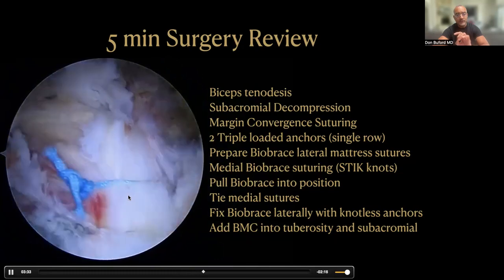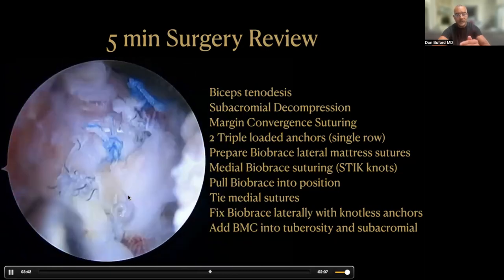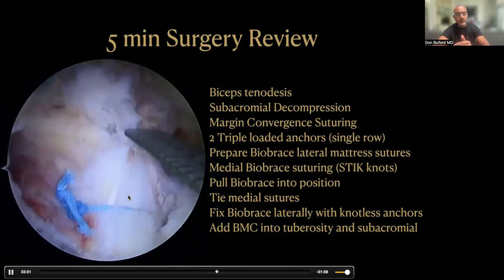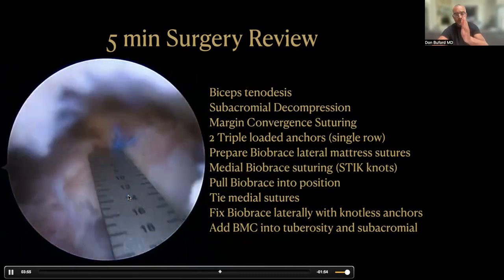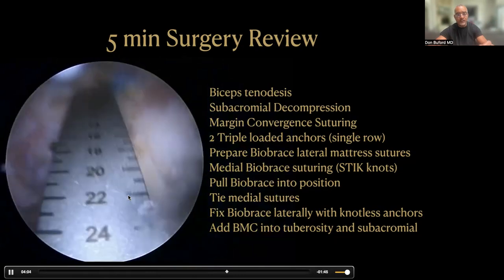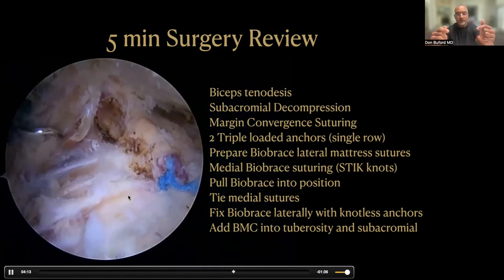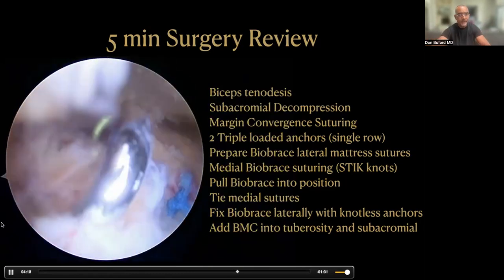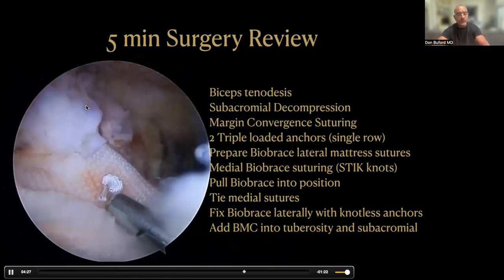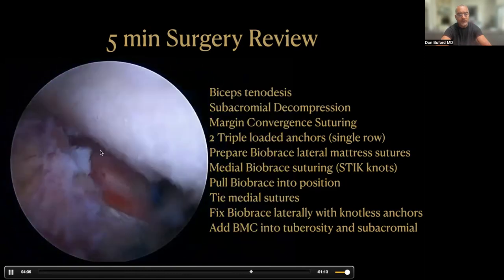Now we have to place our BioBrace implant. The BioBrace is 30 millimeters in the medial-lateral direction, and we'd like to leave about a centimeter to cover the lateral aspect of the repair, so I'm measuring to see about how far 20 millimeters is on this repair. We center the BioBrace directly over that margin-convergence suture line, right down the middle of the rotator cuff. The BioBrace is 23 millimeters wide, so we place one suture posterior and the other anterior with more than 23 millimeters of space between them so the BioBrace is not bunched up. Using the spectrum two set with a shuttle relay retrieved out of the anterolateral cannula, we make the stick knots and pull on them to bring the BioBrace down into the subacromial space.